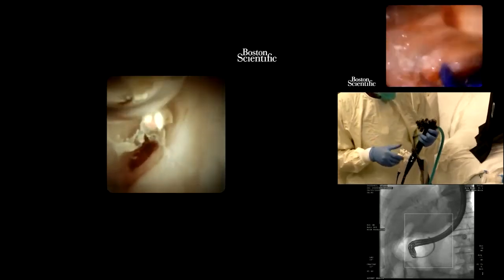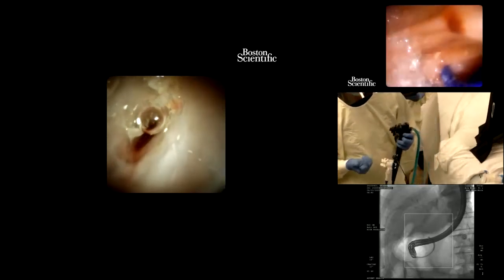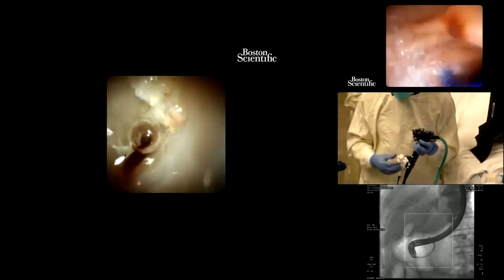So once more, I've got that mass. I'm going to tighten it up, close, and then we're going to perform our last biopsy. That's it. So with this, we will now proceed to putting all these additional specimens in what we call a cell block, so that it goes to the lab and they will store it and leave it for the oncologist to make a determination of whether molecular profiling is required. So I think we are done with SpyGlass.